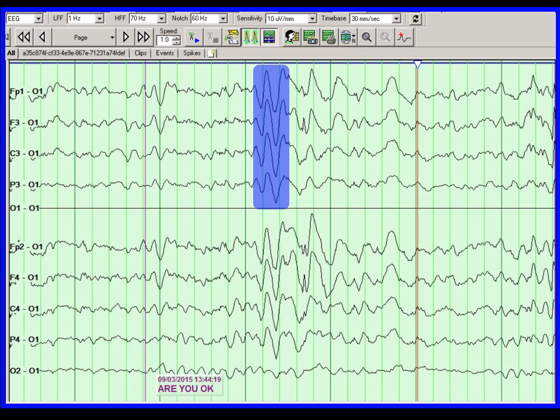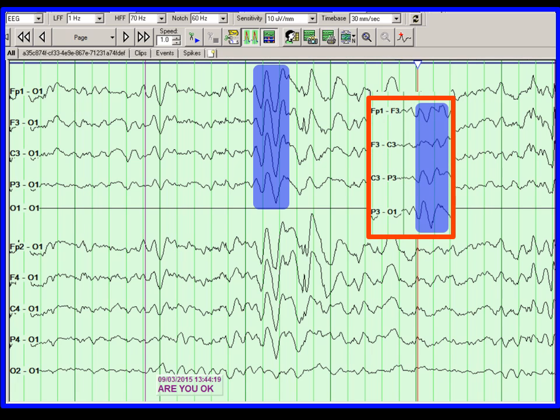Changing to a common electrode reference montage emphasizes the widely distributed activity just mentioned. Notice that the amplitude of the wave generated from P3 to O1 is about the same. This activity is now better seen from C3, F3, and FP1 because of the longer distance. Yet the waves generated from P3 to O1 using common electrode reference montage and bipolar montage have not changed.